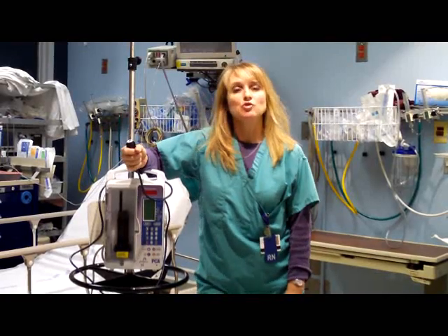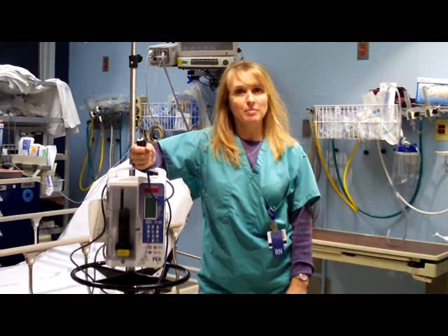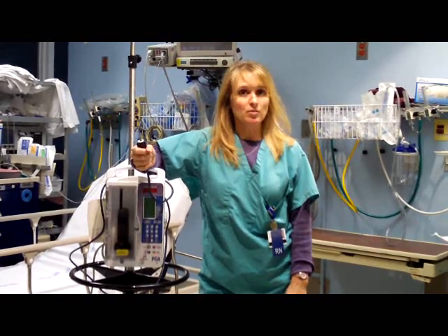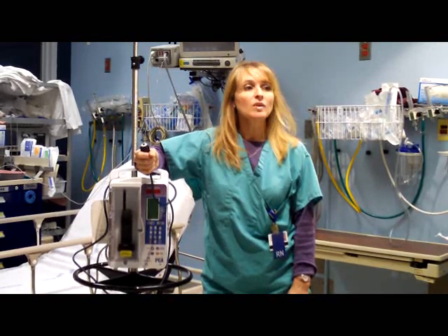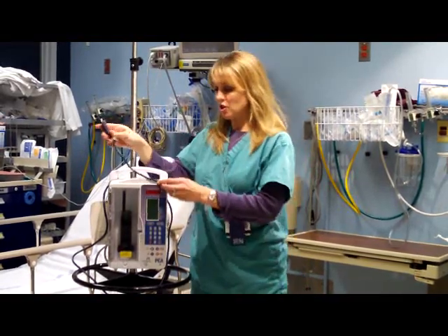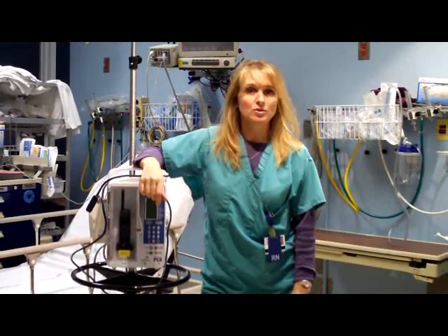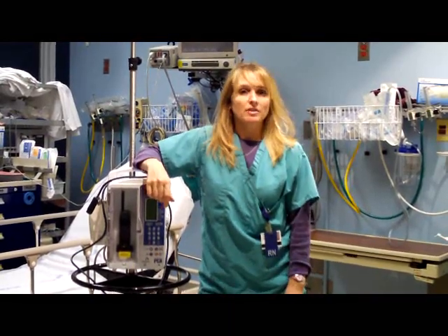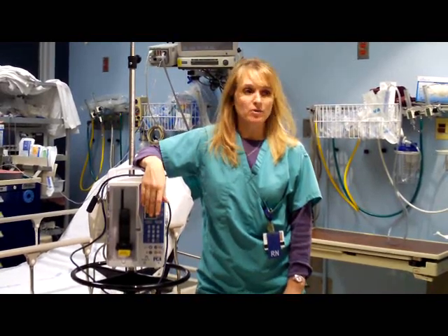It's very important to instruct the patient and any family member present that only the patient should be pressing the button. PCA by proxy, when somebody else presses the button, can lead to oversedation. Once the PCA is initiated, the nurse must check vital signs including O2 sats, level of sedation, and pain level at least every 4 hours.